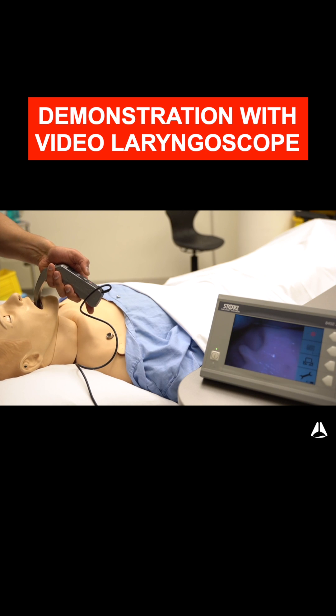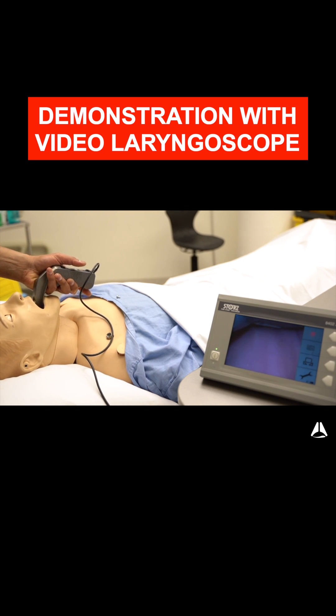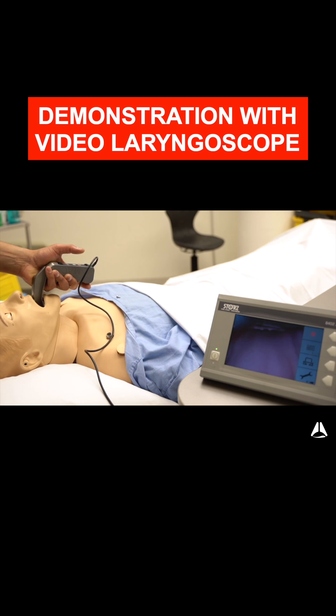So as I go in, I go to the right side of the tongue and you kind of sweep the tongue over to the left. It's hard to demonstrate on this mannequin because the tongue is fixed, but that's the step I would take.